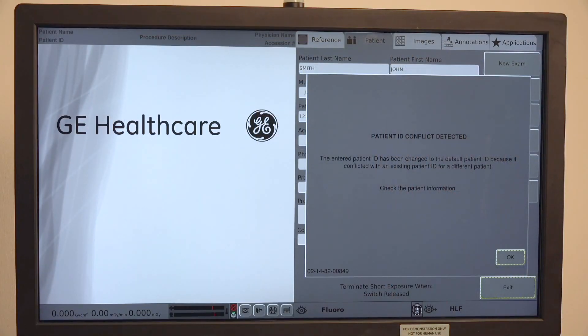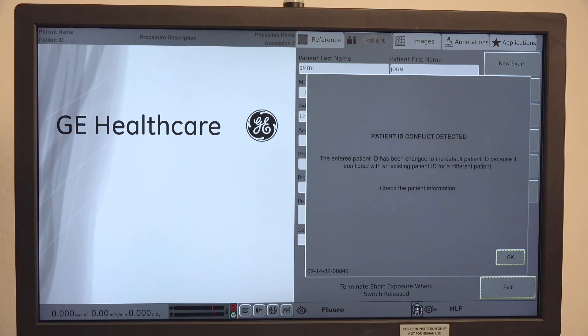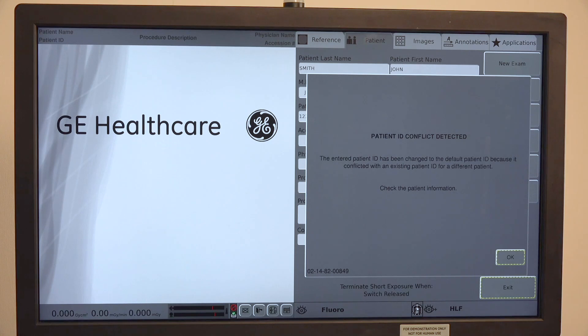Sometimes you will get this message and it says patient ID conflict detected. That means that you were entering in a patient ID that already matches one that's on the system and either the name or date of birth doesn't match what's already on there.